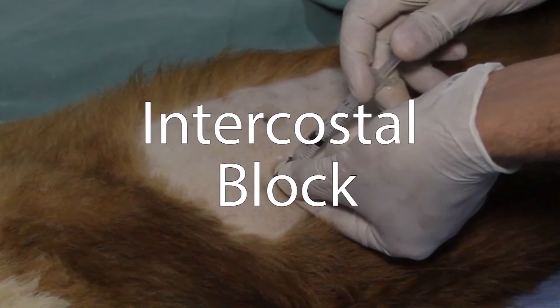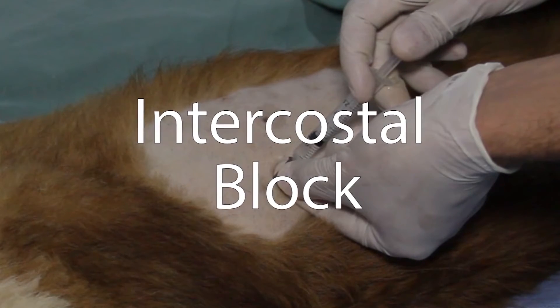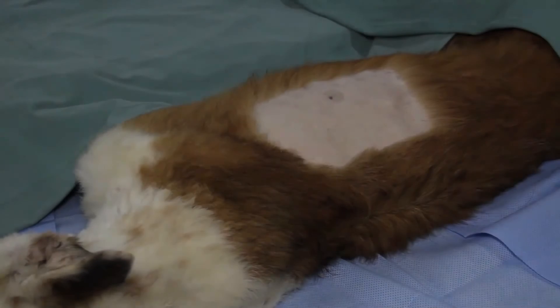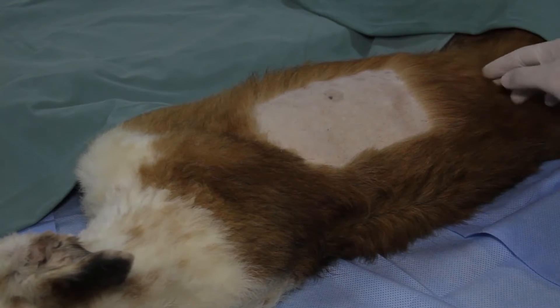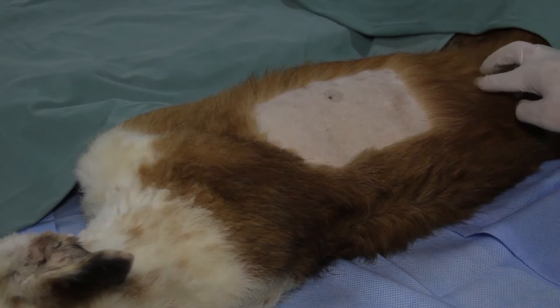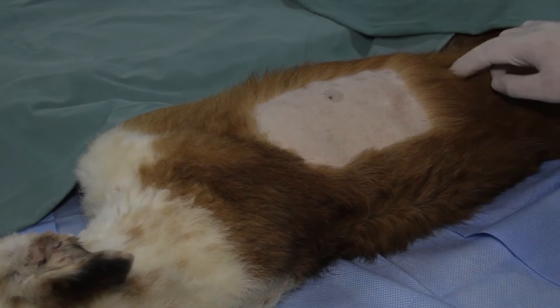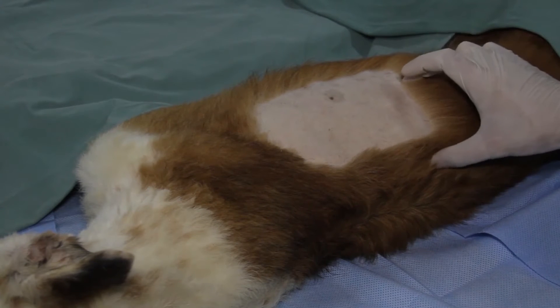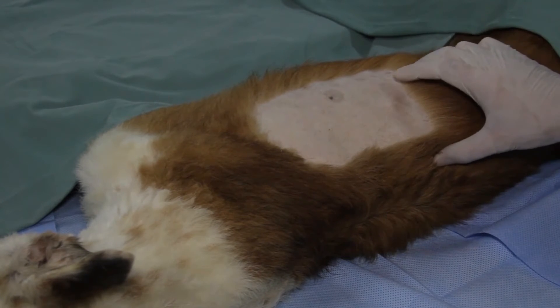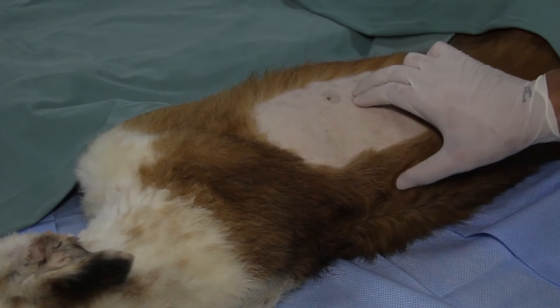Intercostal Anesthesia. With the patient in lateral recumbency, the 13th rib is identified as the most caudal costal arch. The anesthetist palpates each intercostal space and the spinal process for the associated vertebrae, and identifies the nerves to be anesthetized according to the surgical intervention.